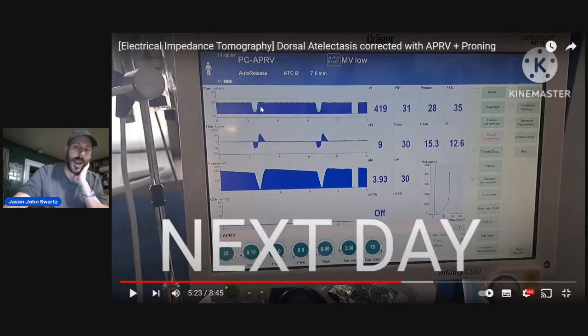If you add a slope, what happens is the viscoelastic property of the lung. So you see the waveform here, it goes up, but when it drops like that, the lung isn't going down and then back up at the same pace. This is the pressure in the circuit going down, and the lungs following behind, and then it's up, and then it's following. So there's a delay. It follows after. It's called the viscoelastic property of the lung.